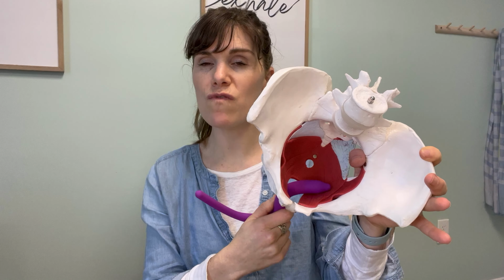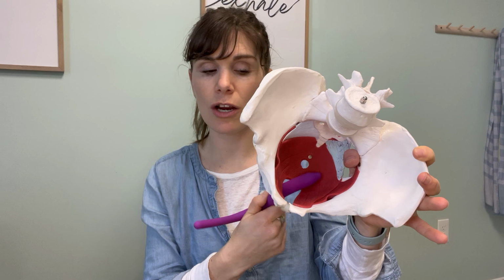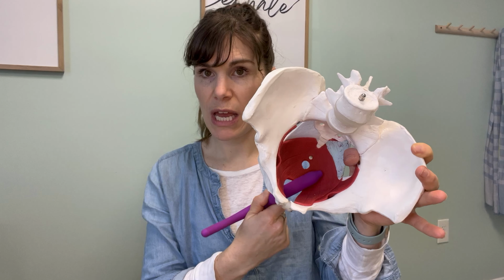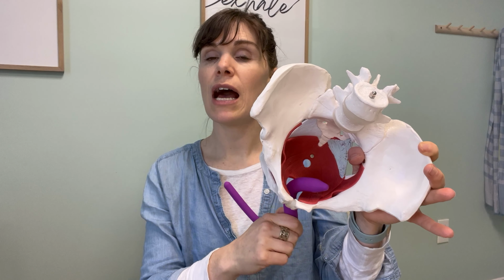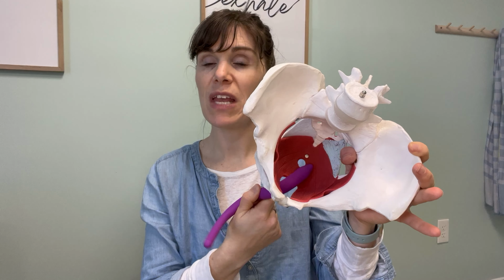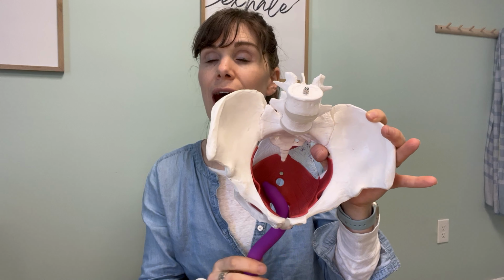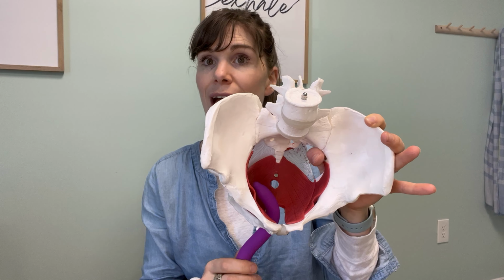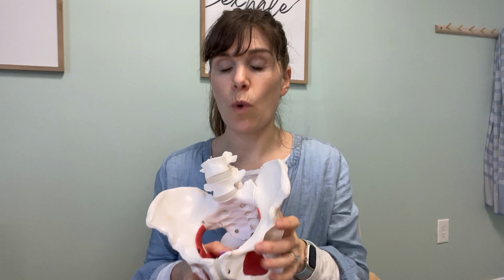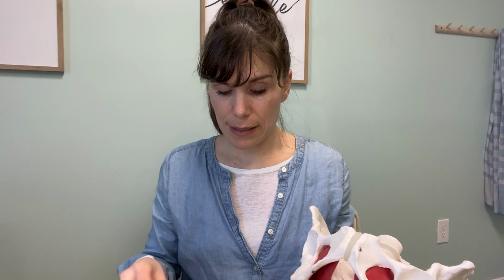You are not really putting a ton of pressure on here. You're doing gentle, calming strokes. And you're breathing as you do this. I want you to inhale as you slide, okay? And you can do 10 to 20 on each side. Again, you can do that at varying levels. Those are two great ways to use the wand to start to address pain with sex after having a baby.